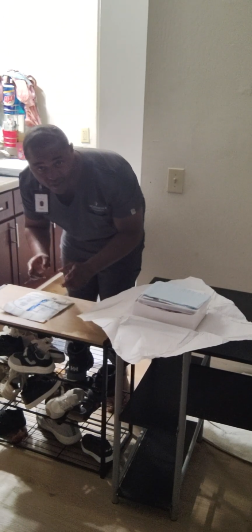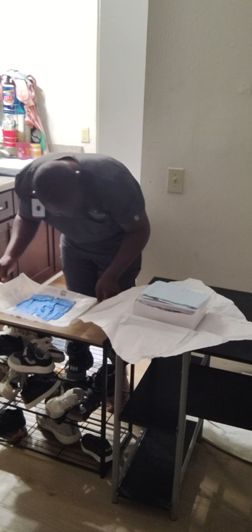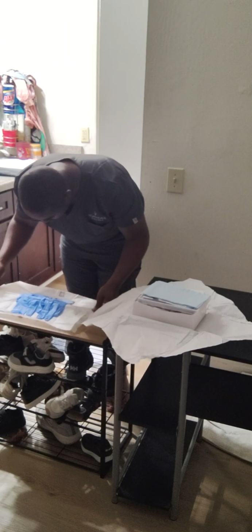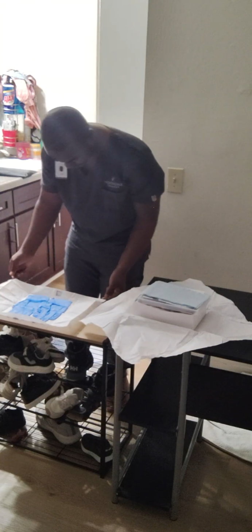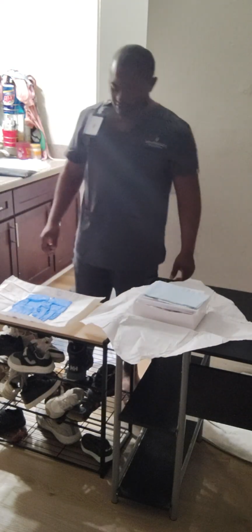Make sure I stay within the 1-inch border, and I want to make sure my sterile paper opens all the way. So at this time I have access to my sterile gloves.